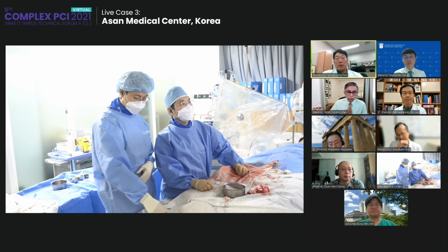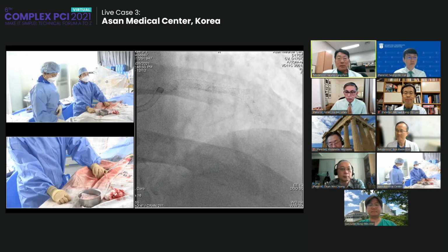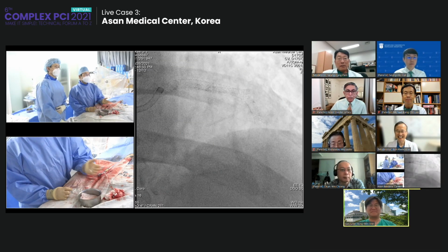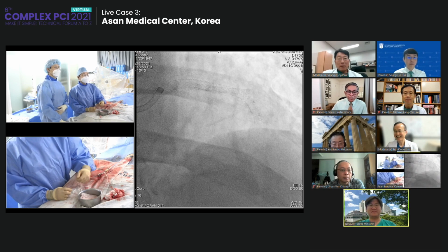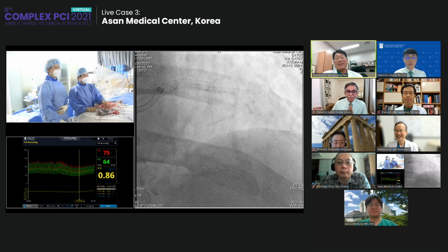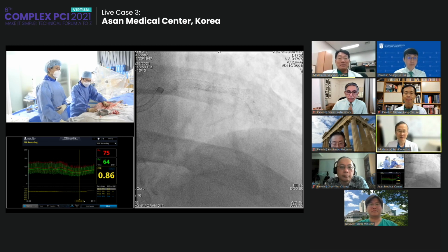Okay, Dr. Lee, what about FFR? Yeah, 0.79. The change to 0.86. We gained the 86? Yeah, 86. All right, great. So even in the diffuse disease, you know, fix up the proximal part. Dr. Gu, are you okay? Yes, this all is right, perfect.